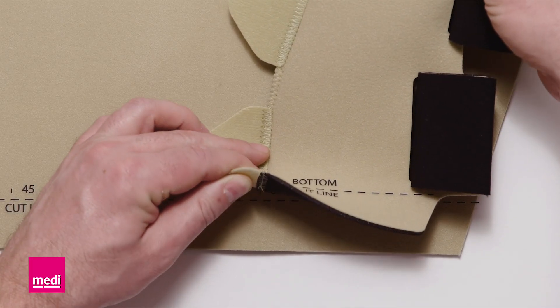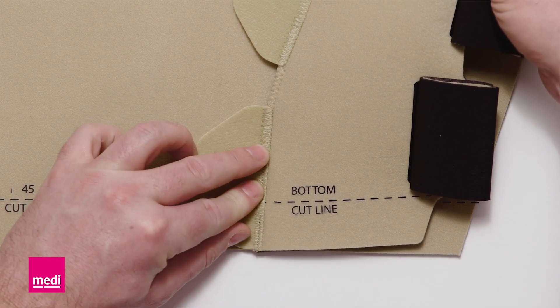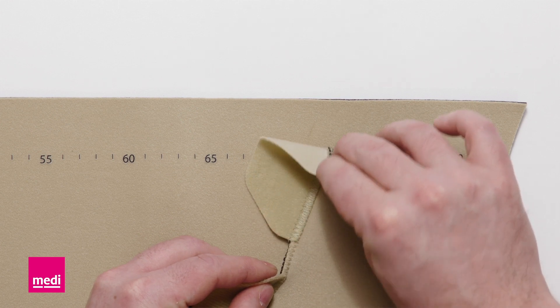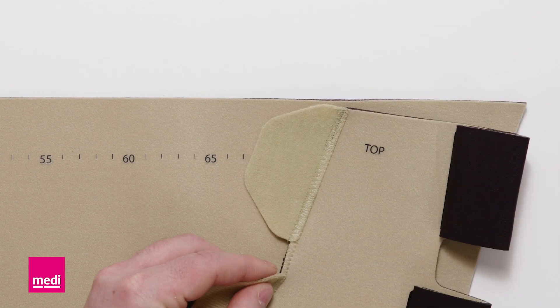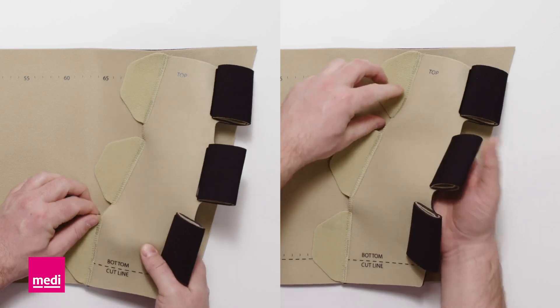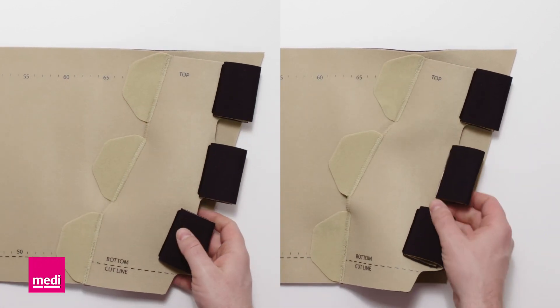The thigh circumference E2 is defined with the seam on the lower numbers, the thigh measurement G on the upper numbers. Adjust the centre spine to create a slight curve. The position of the spine can be adjusted individually for each leg shape.